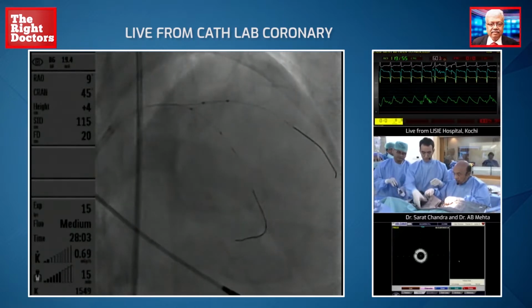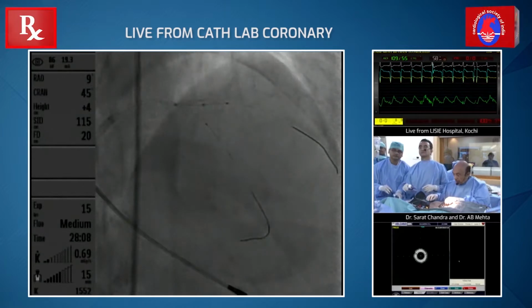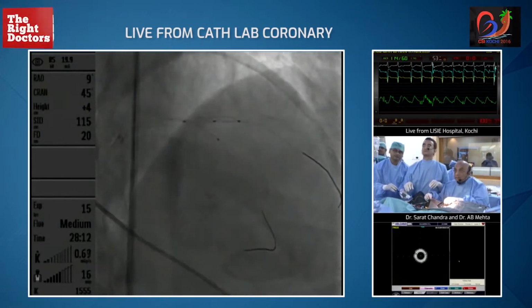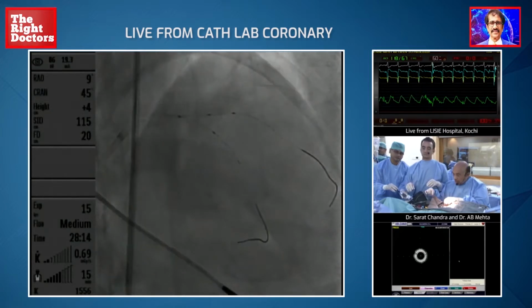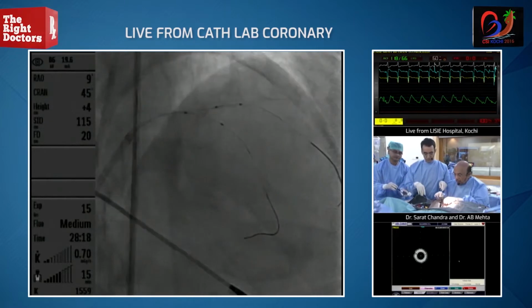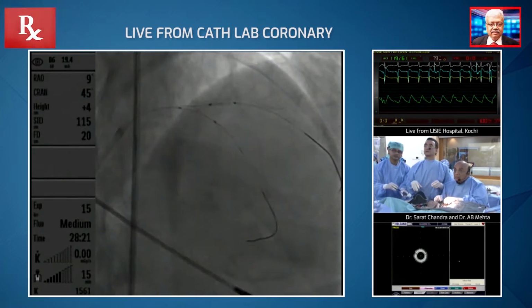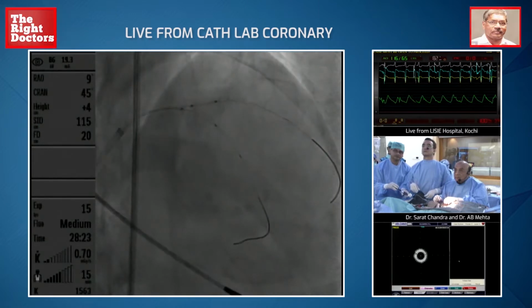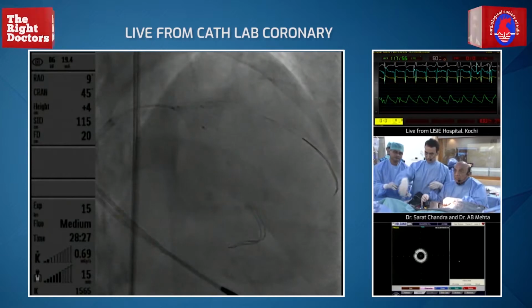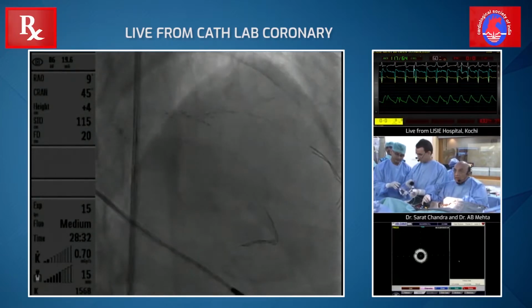This is another balloon. Okay, side branch balloon. This is a side branch balloon? Yeah, this is the one. Lower side. Sir, the one slipping is the LAD balloon. Yeah, I know. If you just hold it, then that will be good. So we'll go, and the side branch is in your hand.